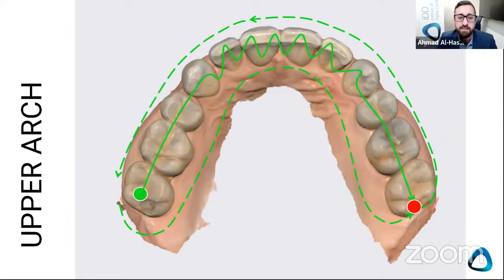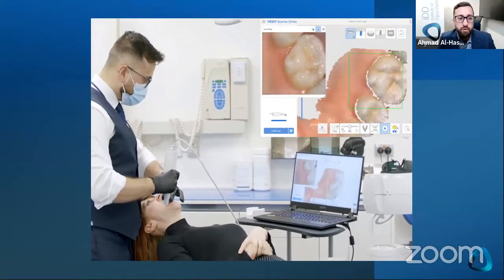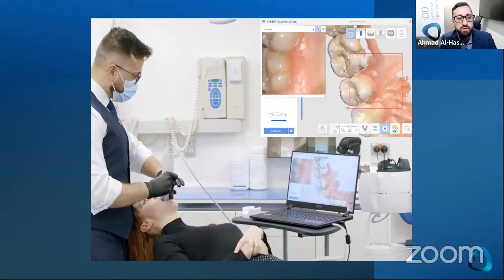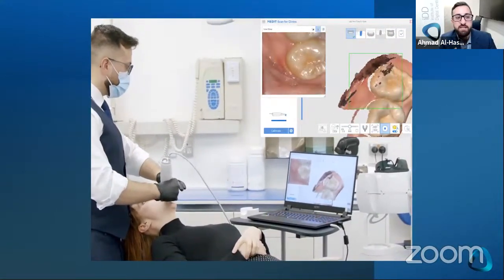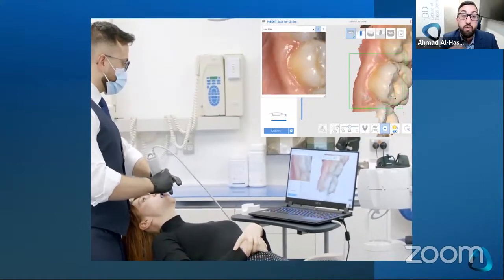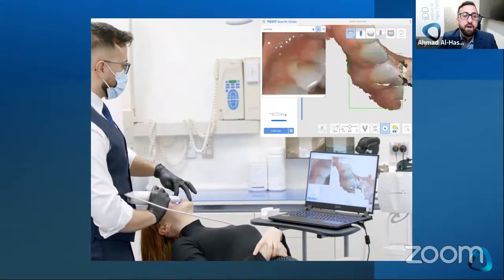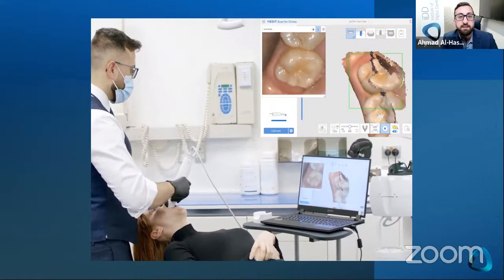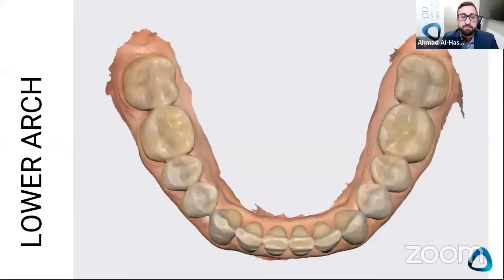And you're going to stop on the other side. If you want to see a video of this in action, because it's all fine to see it on a diagram, as you can see what I'm doing the occlusal first, and now I'm doing the palatal. And when the scanner stops, I go back to an area that it already knows, and I just carry on and continue. You can see myself rotating at the front and now repositioning my hand. And this is really how you take a full arch scan, and that's in 20, 30 seconds.